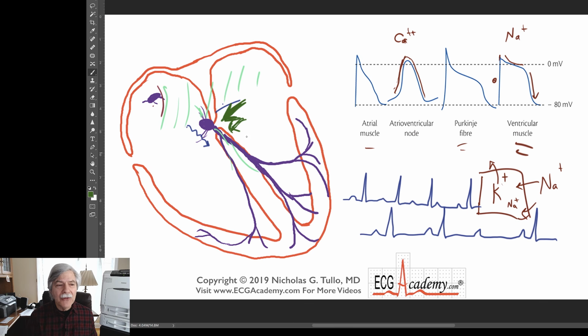The problem is that if you have trifascicular conduction system disease, and by the way, I did go over this in my live stream on trifascicular block, so you can actually go back and watch that one. If you have trifascicular conduction system disease and it fails completely, you may not have an escape rhythm. And that's where you can have problems with syncope and even sudden death, because what you get basically are just P waves that march through and they're not going anywhere and you have no escape rhythm. So I have plenty of ECGs like that to share. But that's why the level of the block is so important.